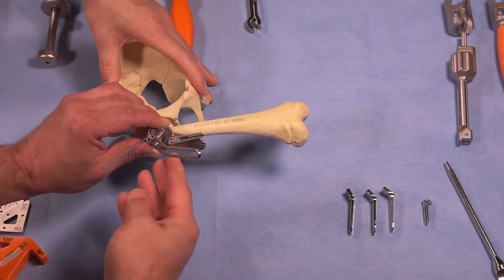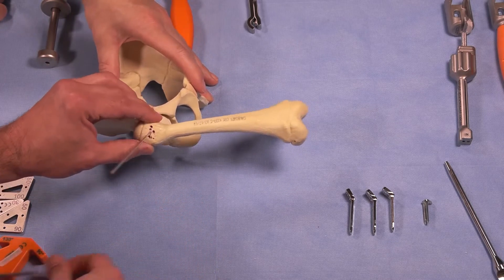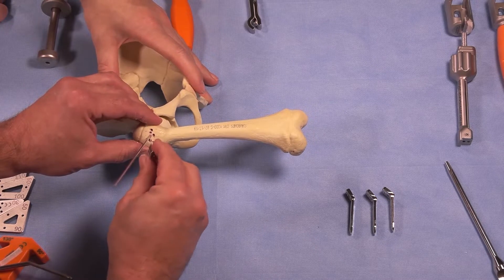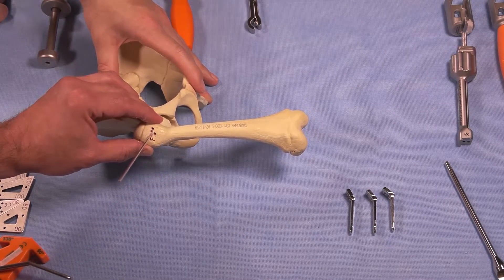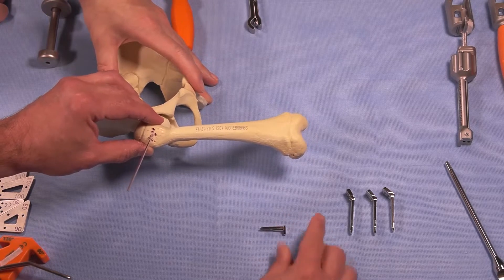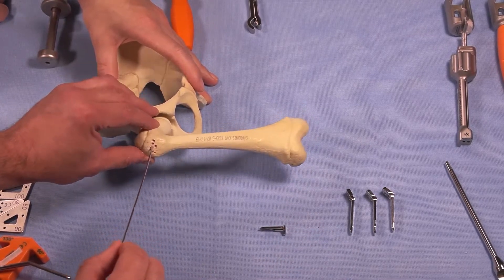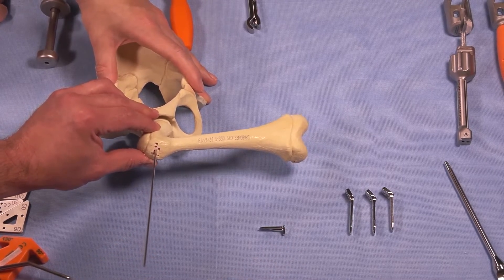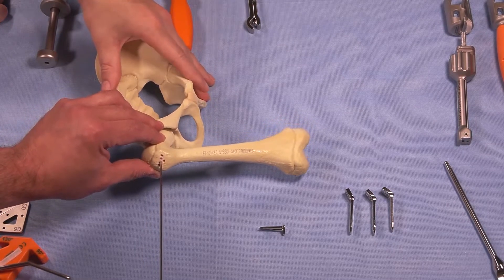Now that the cortex is broken, we have created a footprint for the chisel blade that's going to mimic the 20-degree extension correction. At this point, we want to measure our wire. This neck probably measures a true 35 or 40, but we're going to use a smaller blade because of the material being used. We are now going to insert the chisel blade.